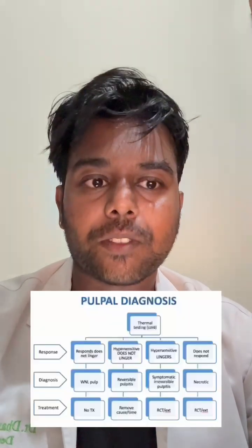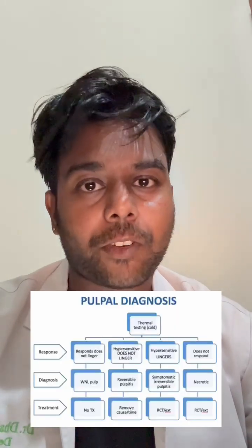Doppler flowmetry. In our daily clinical and chairside practice, the common tests which we will be using are the cold test and electric pulp test. The cold test is usually performed with refrigerant spray, ice sticks, and carbon dioxide snow, where a cold stimulus is placed upon the patient's tooth surface and the patient's response is recorded.